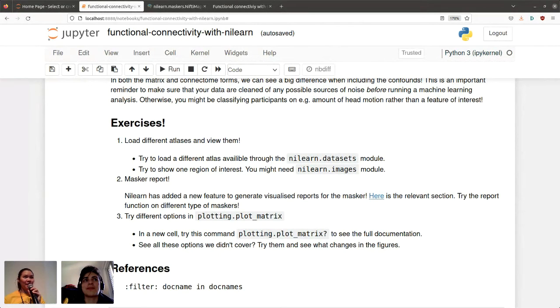Right, so now we have a few exercises. There is one question, and maybe Hao-Ting, you're better equipped to answer it, or maybe we need a more specific question. But I see here it says, "How do confounds work under the hood?" Right, there are many things to unpack from this question.